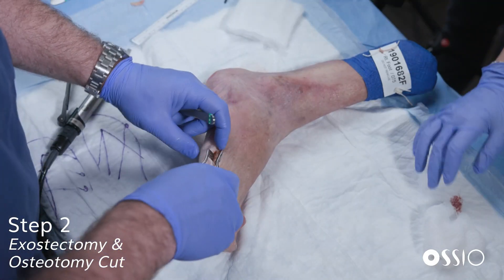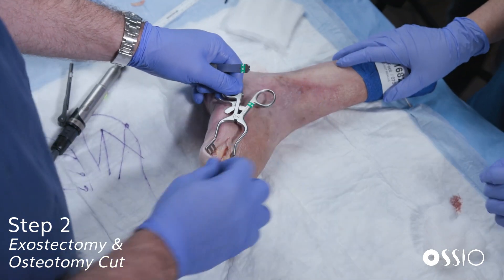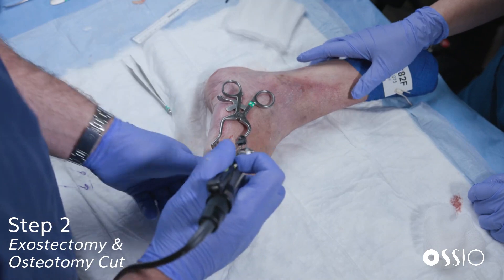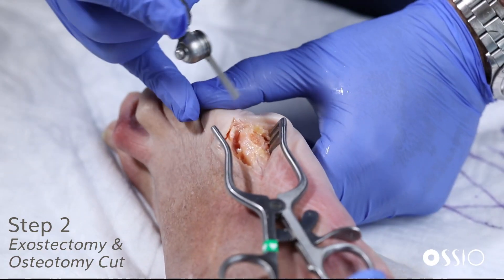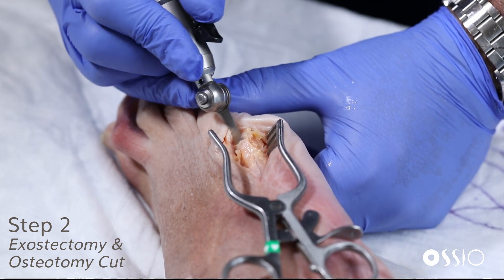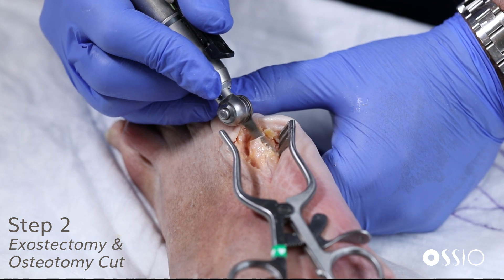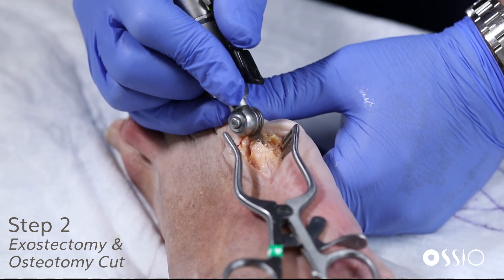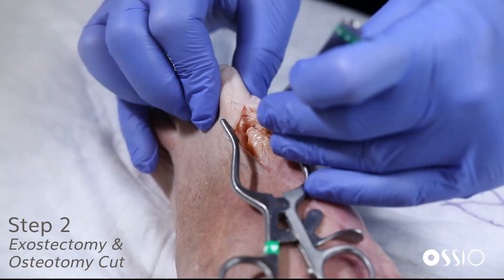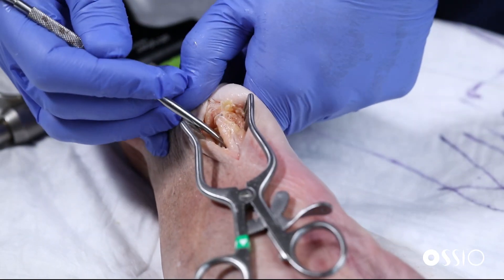Various different osteotomies could be used at this point, whether a miniature scarf or a chevron osteotomy. I typically favor a longer, mal-type osteotomy, almost like an extended weil at a much flatter angle. It starts from the distal metatarsal head and goes more proximally. You can do this from the dorsal approach, as I'm showing here, or even from the lateral approach. I favor that long osteotomy so you have a nice broad bone surface that you can translate, rotate on, and also accept multiple fixation points if needed. This tends to be a very stable osteotomy because weight-bearing actually closes it down.